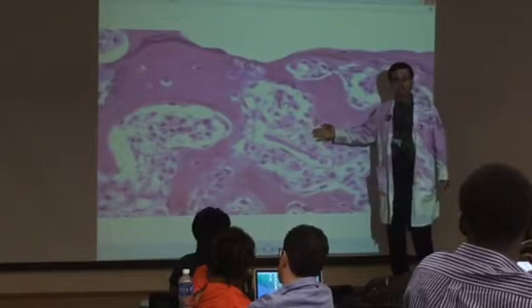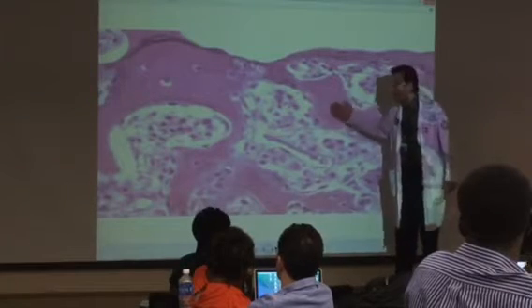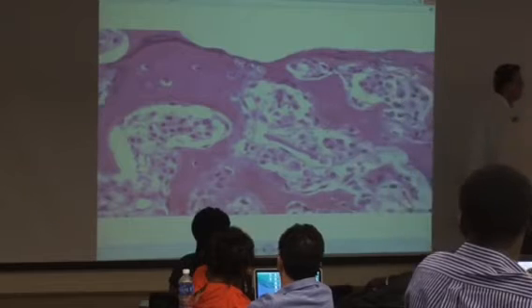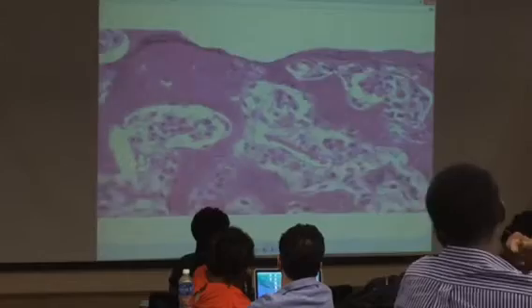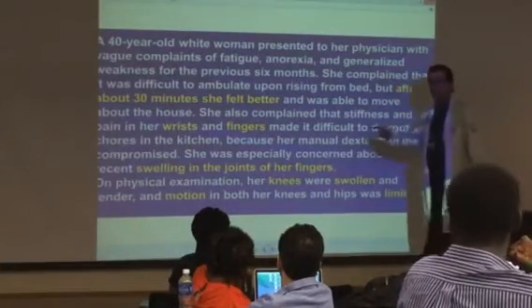This is a prostate. So this is an example of prostate. Remember, the prostate produces bone, activates osteoblasts, and then you're gonna have an osteoblastic metastasis. So you can see all this thickened bone, but it's not stable. Very fast about this case.